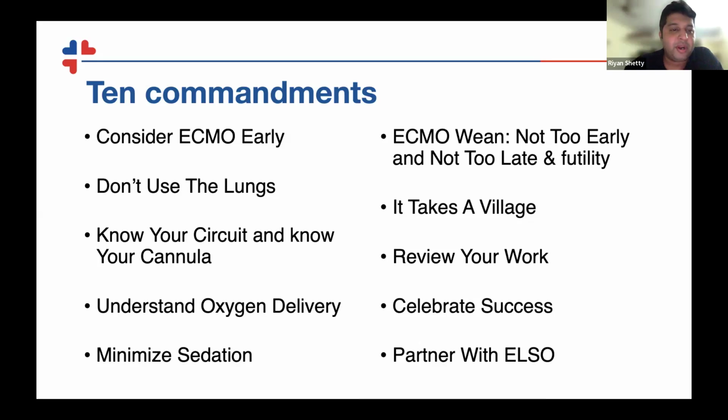any newcomer. So always consider ECMO early. I did not say initiate early, I said consider early. Rest the lungs. When you are in lung failure and you have rested the lungs, do not bang the lungs and cause volutrauma and barotrauma. Know your circuit and know your cannula. Very important. There are algorithms and charts to show you what size cannula you need for which configuration of ECMO, by age.